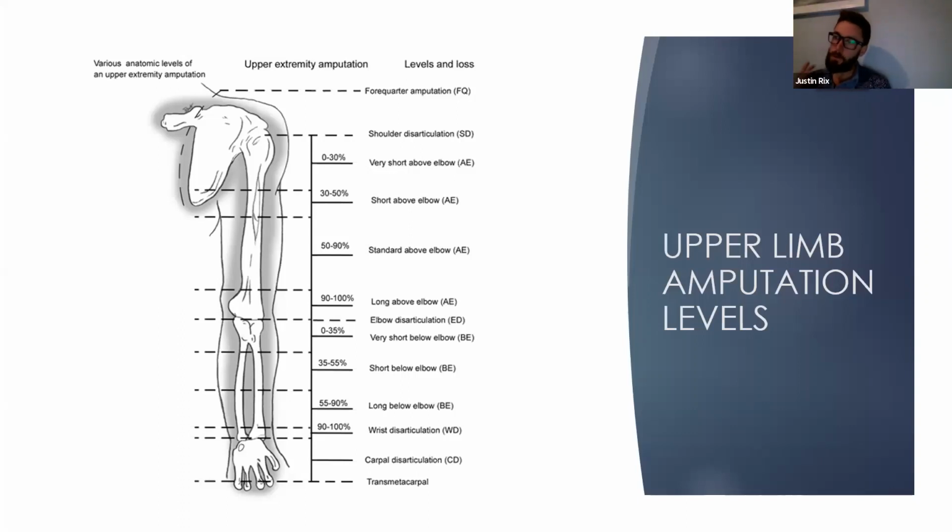With upper limb amputation, we have similar considerations to lower limb amputations, where we look for severe scar tissue, especially with myoelectric prosthesis, because you rely on a good residual limb to place your electrodes, bony prominences, excessive soft tissue, hypersensitivity, and too short a residual limb. We have issues with our prosthetic suspension, and also the space required to put all these components in.